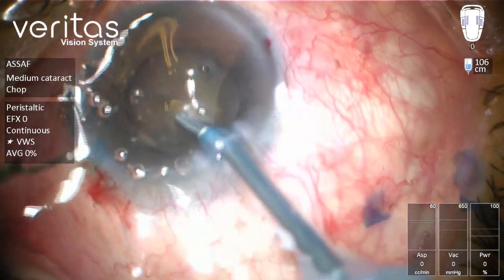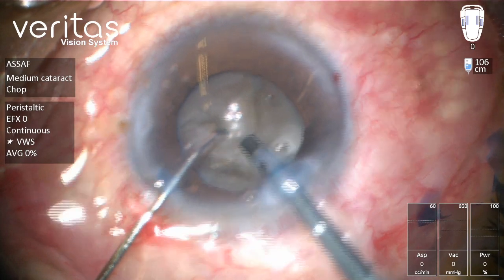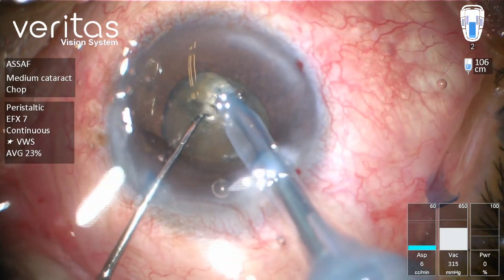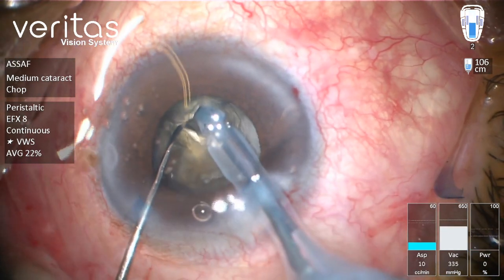I prefer to use a vertical chopper in this case of poor pupil dilation because we can work on the central area activating vacuum only, trying to split the nucleus with the vertical chopper into two parts while they are still attached together.